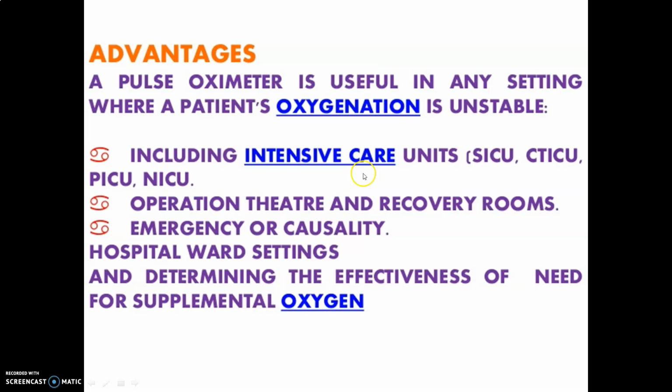Intensive care means your ICU, right? I have already discussed before. In the ICU, all the patients who are admitted, we always connect them to the pulse oximeter and BP cuff. Always we are recording them, because at any time they may fluctuate. If it is getting low, immediately we have to connect them to oxygen. That is why it is very important, even for ward patients who have any kind of disease, and even at home we can keep it as a safety measure.